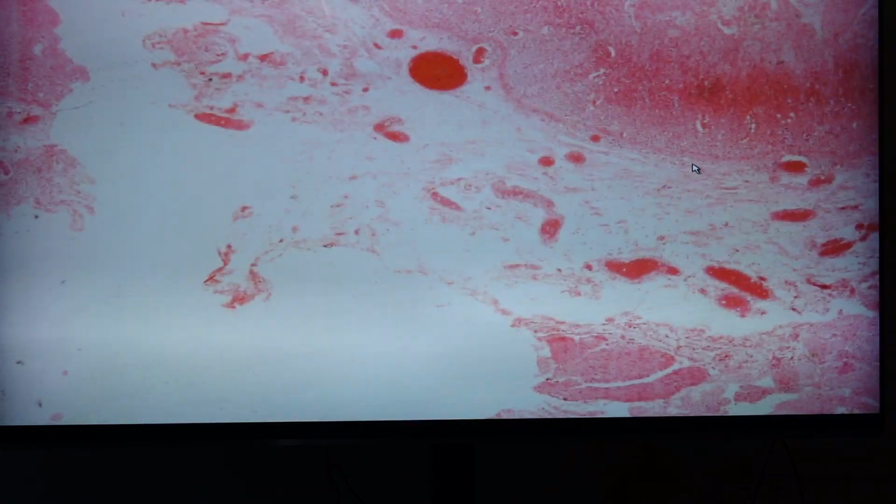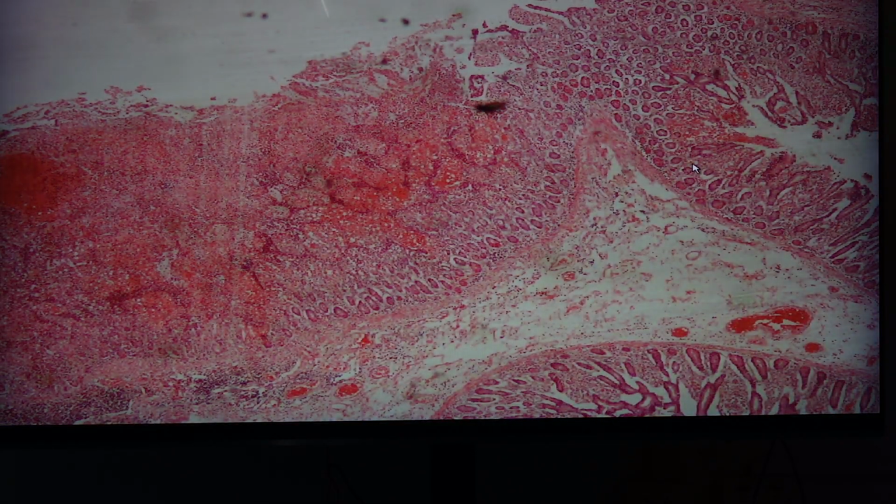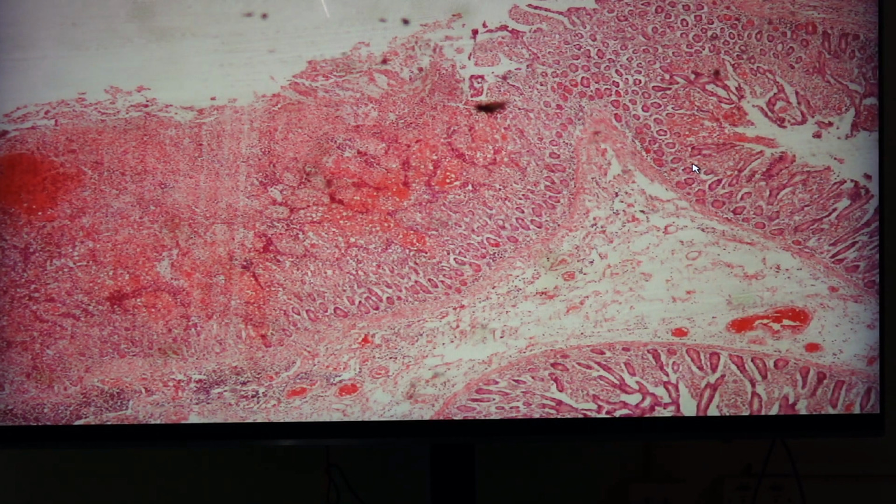Okay. So last slide is slide 106. This is ischemic bowel disease or acute infarction of the small bowel. So what is the reason why our patients would sometimes manifest with this one? Okay, so here. So ischemic bowel disease can be brought about by hypoperfusion.